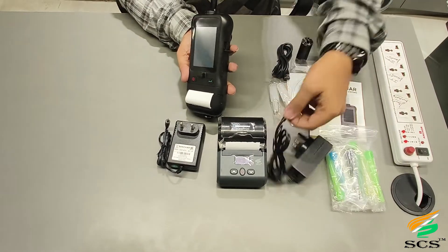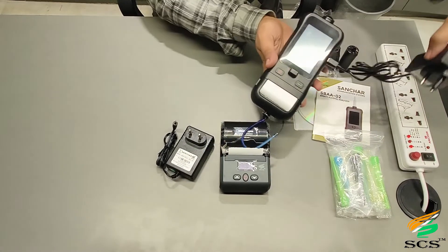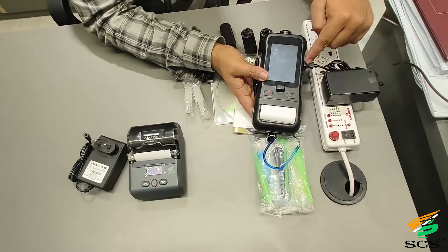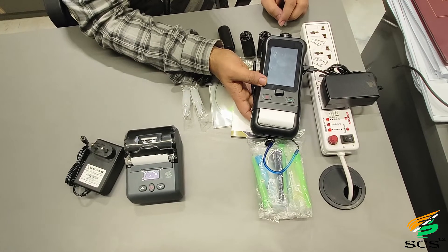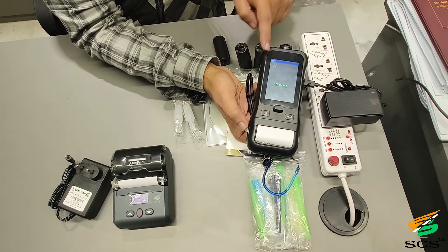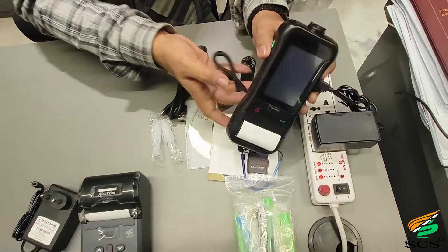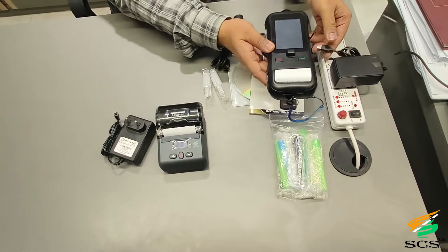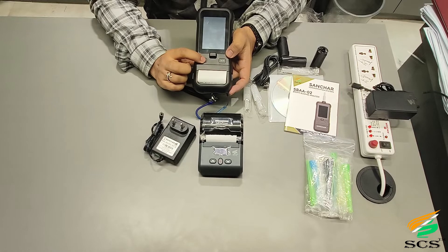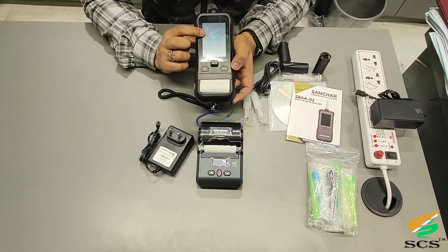You can put this charger in for charging. By a single press, this shows charging and this is the charging light. Press and hold the power button to turn on the device — this is the SCS logo.